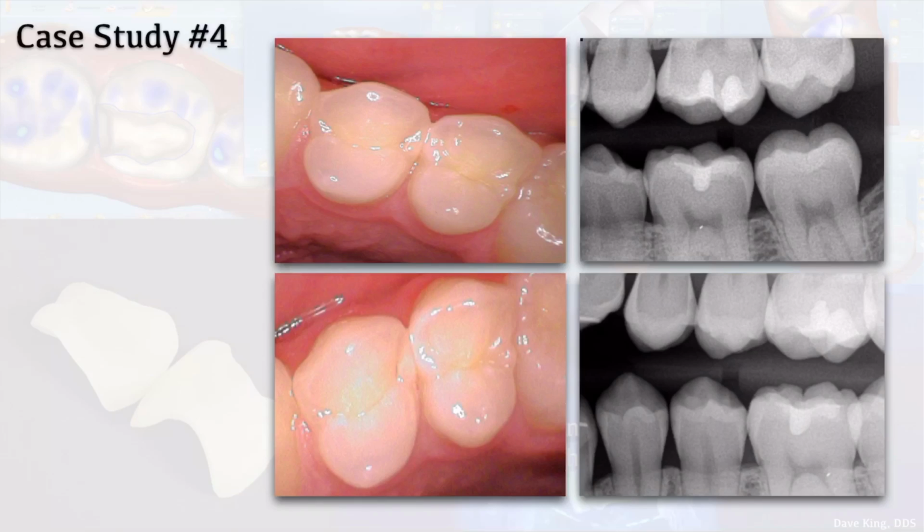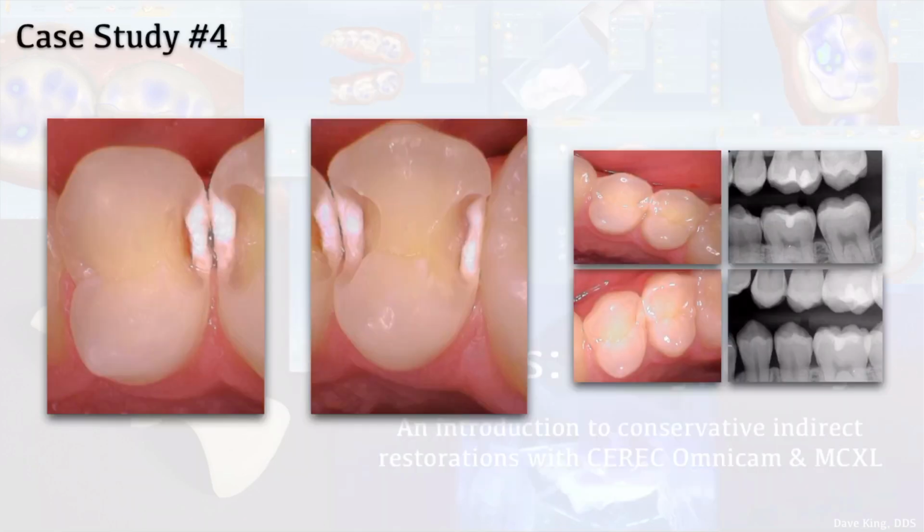He didn't really believe me that he had cavities. He couldn't really see those dark spots. This one's a lot more visible there. And so you can see a couple incipients down there. So I told him, well, I'll take some pictures once we open it up and show you what we look like. So here's what they look like. Yeah, those are pretty obviously cavities. This area I'd call incipient. There we've definitely got recurrent decay, broken through the DEJ. So yeah, all these definitely warranted restoration there.